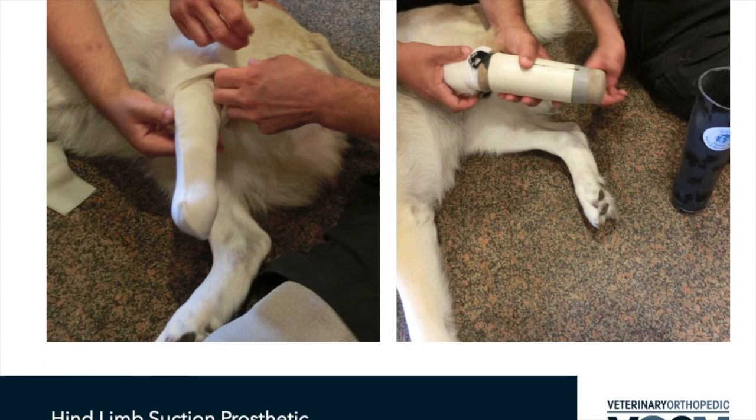So just like before, we're going to be making a mold. Okay, so we take a stockinette or a little sock type material, place it over top of that, use a harder material to create the cast mold, sent off, and then we'll have the device brought back and applied to the limb. And so here we have a sock and a gel insert that will go over top of the stump.